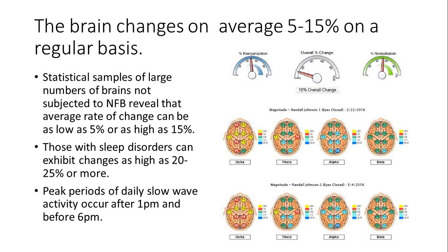Okay, even higher sometimes. So if you have a sleep disorder, you're not sleeping well during the day, you're going to have higher levels of delta and theta, and perhaps even alpha, because you don't have much energy, and a lot more of the dipole regions and networks will be on idling and awaiting more energy food in order to gear up and process stuff. So you'll see that elevated pattern in somebody training. Now, if they have a sleep disorder, they may have lower levels of delta and theta in the morning and higher in the afternoon. Why is that?